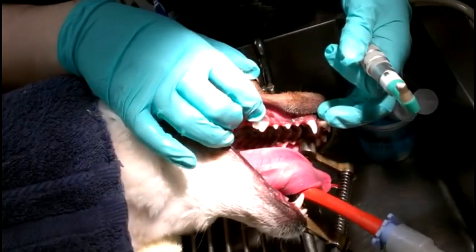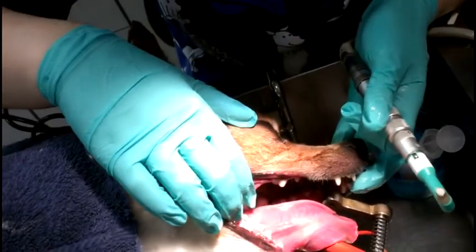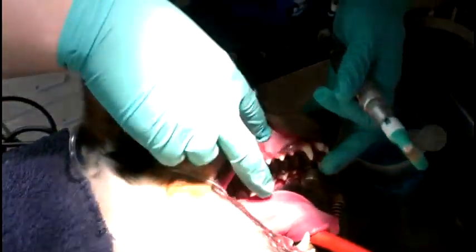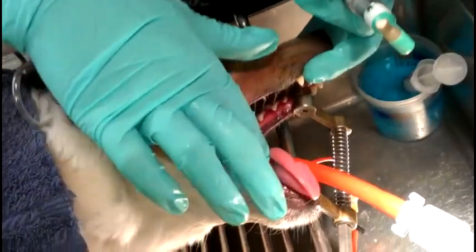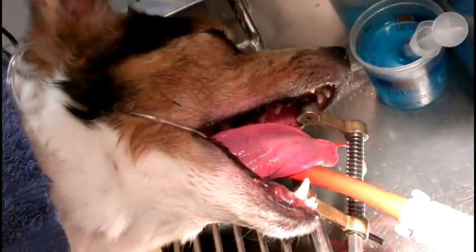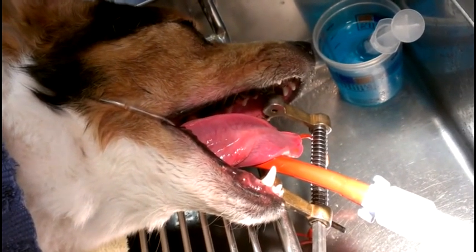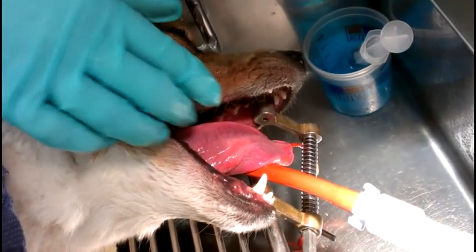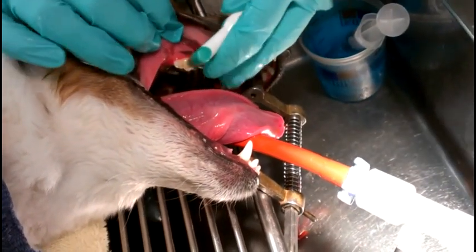This side of Mabel's teeth are all clean. We got all the tartar off. Everything looks really good. We also took off the tartar on the inside of the other side. Well, we can see it real well. The next thing we're going to do is polish her teeth, just like they do for you at the dentist when you get a cleaning. We do the same thing. Mabel's lucky enough to get some mint paste today.